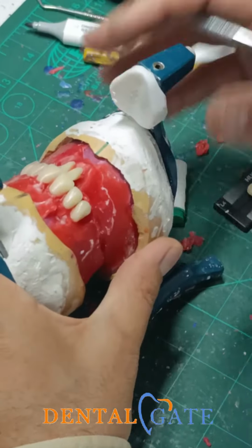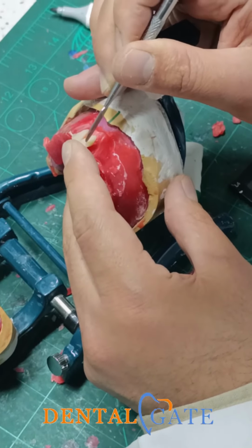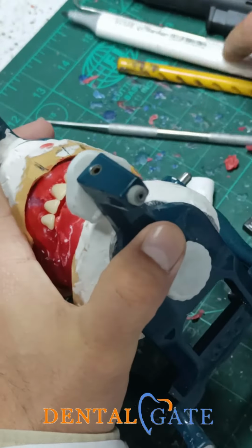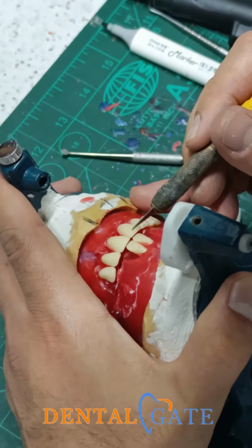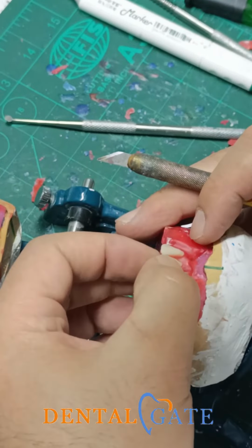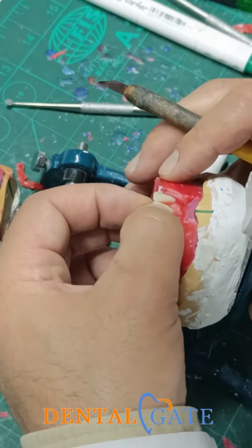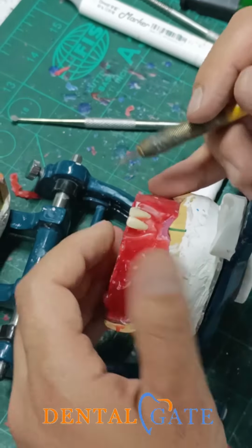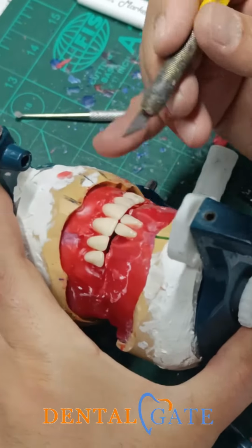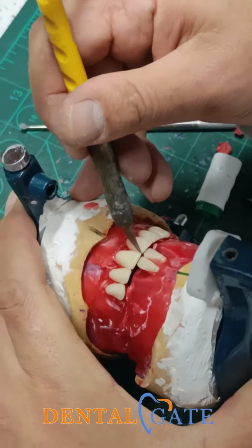So make a double check here. Now I think the curve will start from here. Now make a double check. Regarding the curve of the upper, it is good, but here we have a mistake, and then we will make a turn to the central incisor, to be in the same orientation as the other one, and now make a check. It is good. Now we have a midline here. We have a midline here.